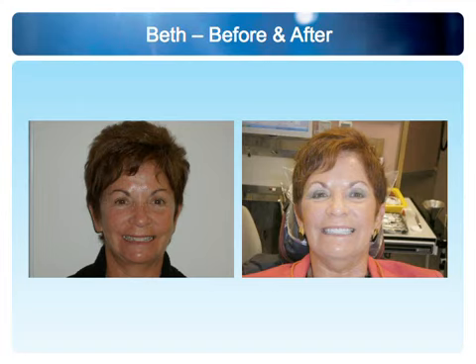You are looking at teeth that are unrestored. It's her own enamel. There are no veneers or crowns across there. But having established a nice pattern of developing and treating arch form and arch width, we can align all those teeth and maintain a nice midline. And having all 4 teeth in place gives the patient a midline and also a beautiful smile.